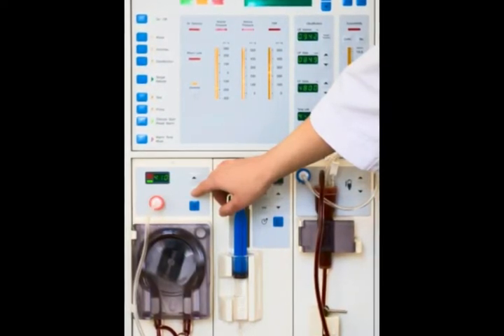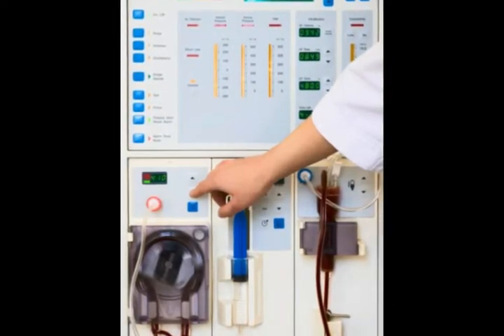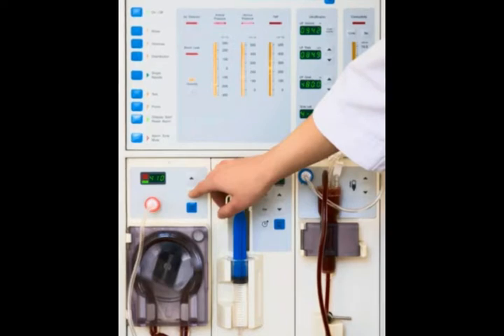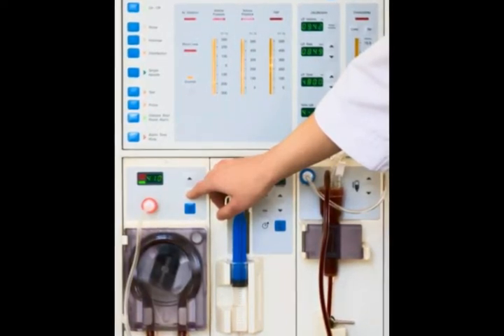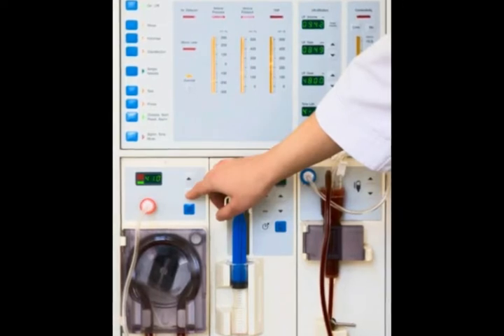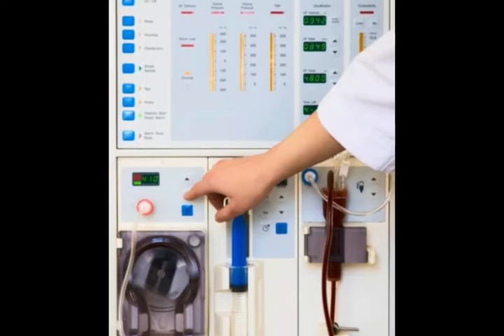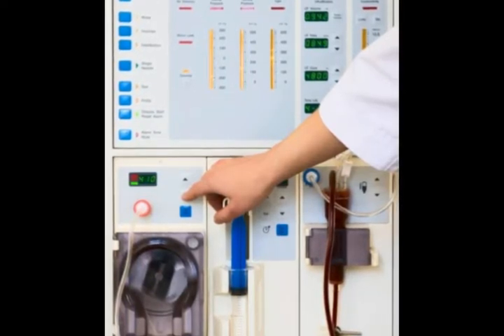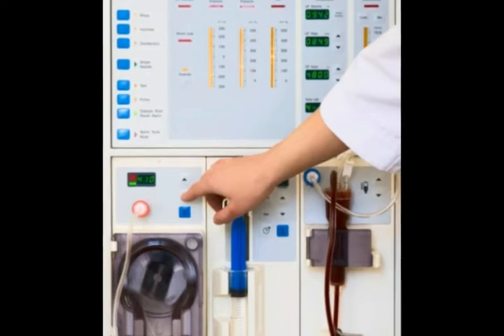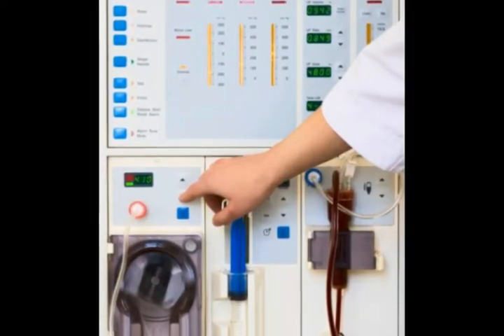In hemodialysis, blood from the patient is pumped out of him or her through a needle or catheter to a dialysis machine. The dialysis tubing is inside the machine, surrounded by a sterilized solution called a dialysate or diffusate. The dialysate is most commonly water with electrolytes, sugars, or other substances as solutes, with the precise composition varying according to the needs of the patient.